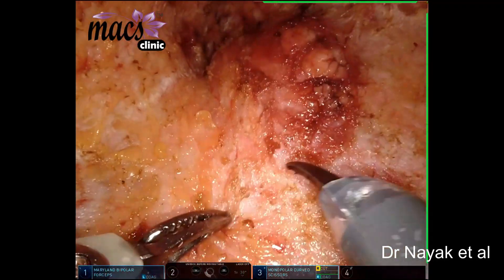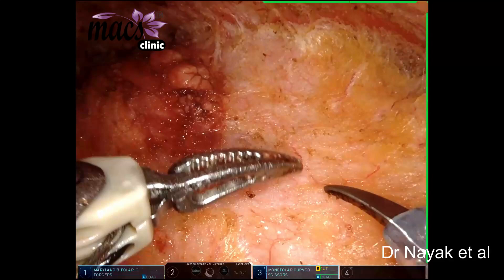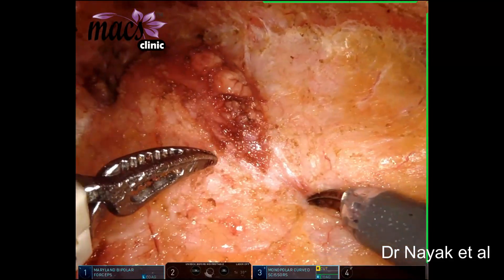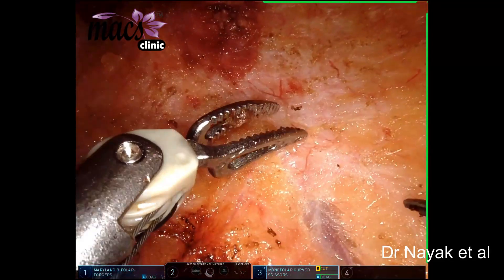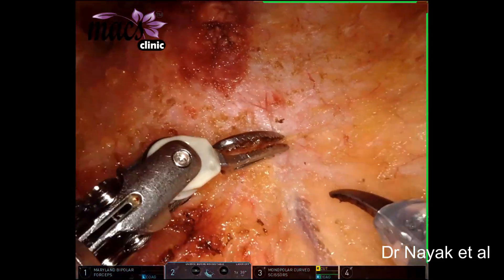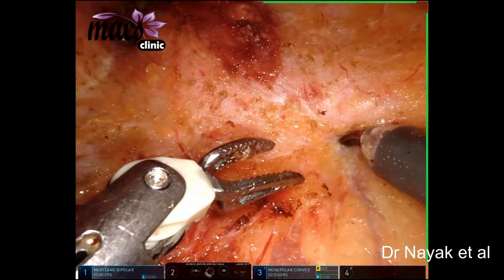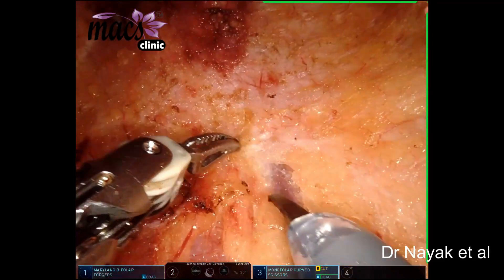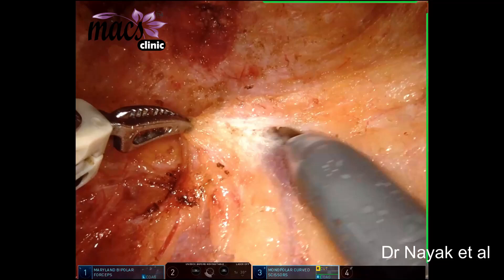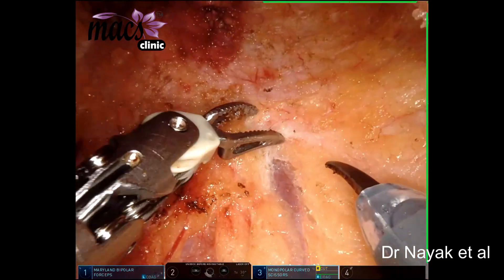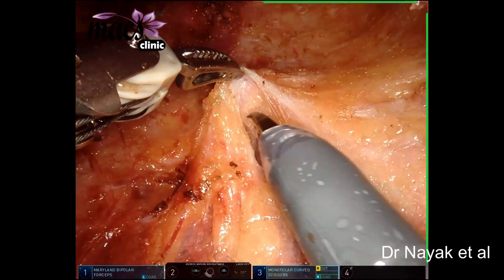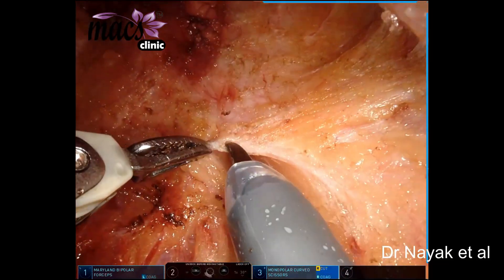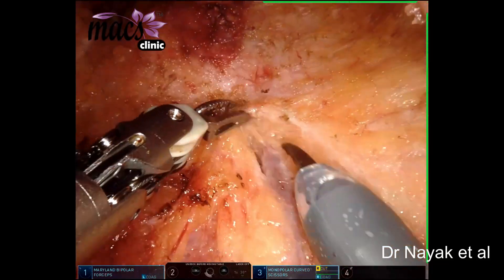This is a pleomorphic adenoma as per the FNAC report. We generally use two instruments and do not use a third arm.